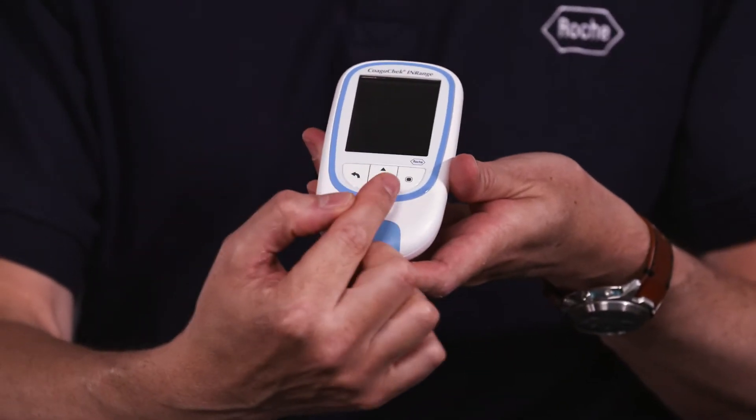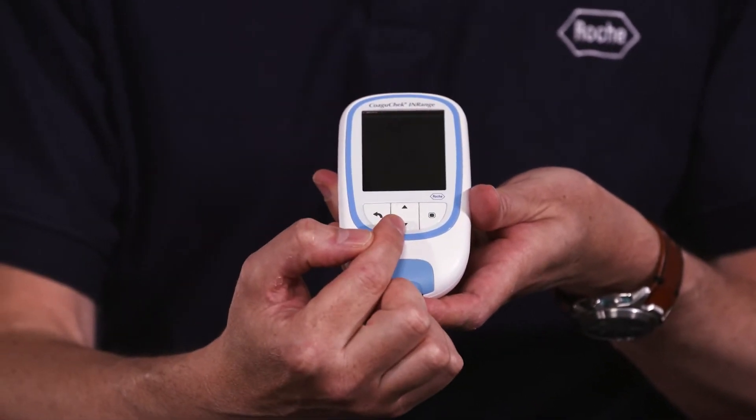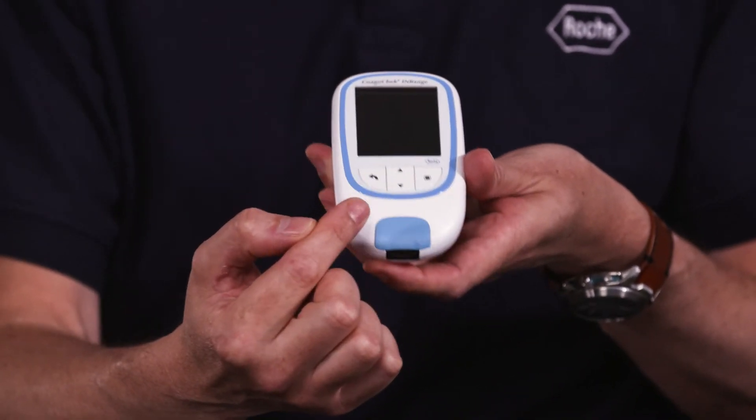On the front of the meter you have your screen, your power button which is also your confirmation button, your up and down arrow keys to navigate through the menus, your back arrow key, your strip guide cover and your strip guide.